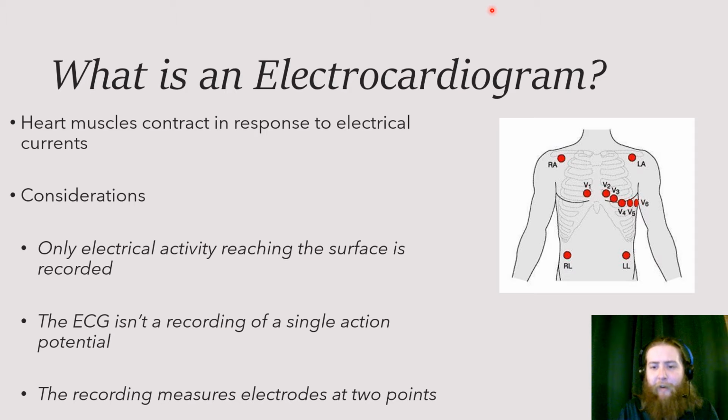Now, this is done as this heart muscle is contracting. This is in response to electrical currents inside of the heart. And as these electrical currents drive the depolarization and the repolarization of the heart, some of this travels through the liquid parts of the body and reaches the body's surface.